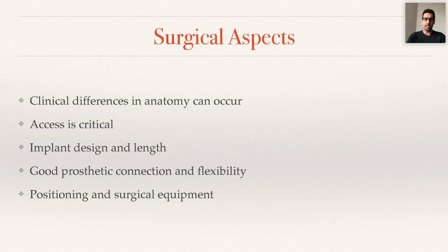Okay, so let's just go over some of the surgical aspects. Something I heard early on when I was learning pterygoids, a colleague described this: it's simple surgery, but it's in a complex territory. So pterygoid implants, for me, I'm a big believer, are simple surgery in a complex territory. So we really need to be appreciative of the anatomy because it is a blind technique to a degree. Clinical differences in the anatomy can occur, so please note that not every patient is suitable for pterygoid implants.